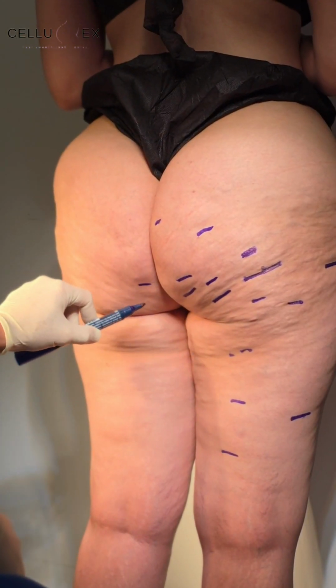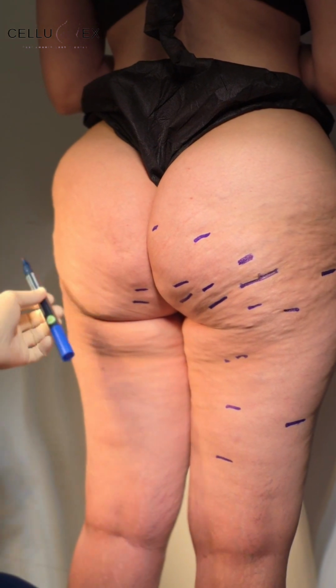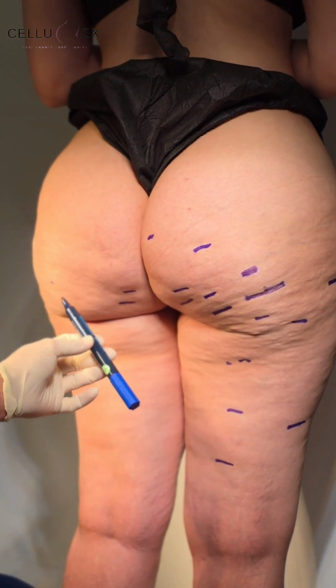There is one here, one here. Tighten, please. Tighten the buttock, yes. Okay, more. Tighten it again.